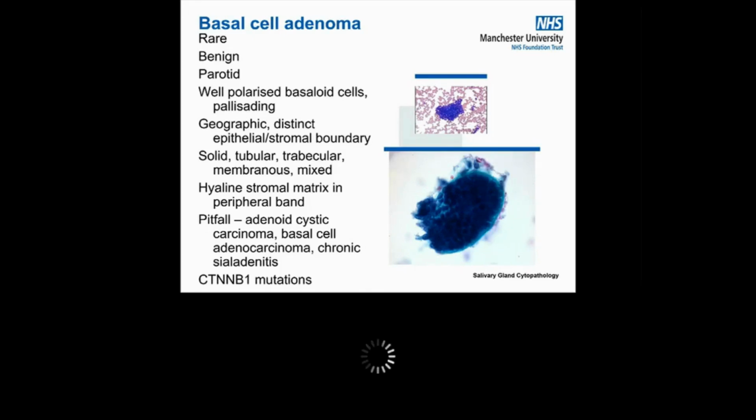The pitfall here on cytology is between adenoid cystic carcinoma and basal cell adenocarcinoma, which is indistinguishable on cytology. And as I mentioned, we can overcall chronic sialadenitis as basal cell neoplasm.